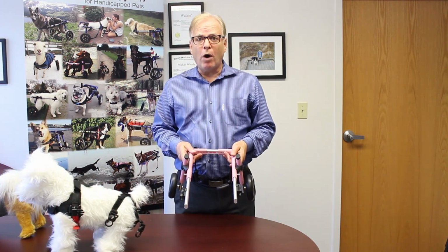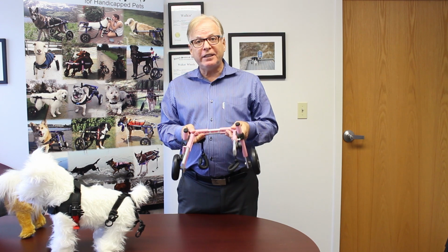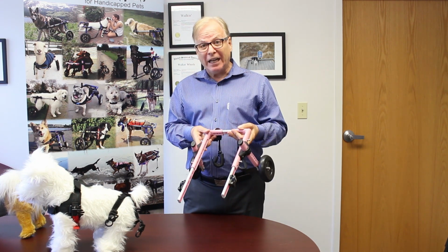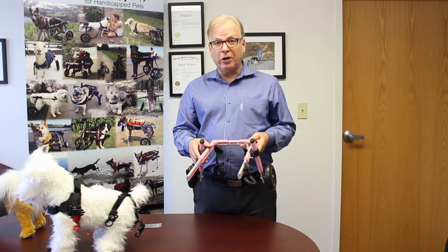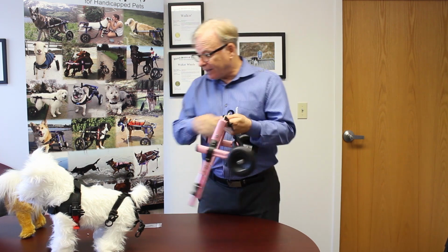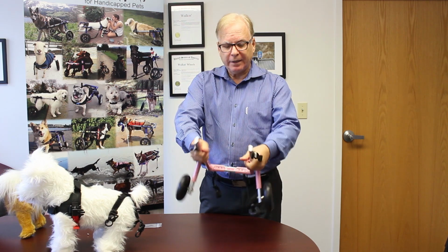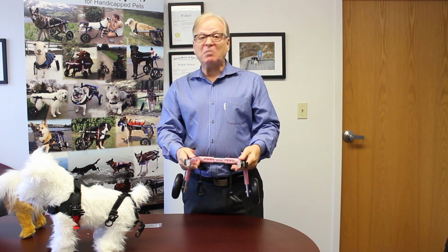You mentioned that the cart was a little bit wobbly. I understand that. When we originally designed the cart, it was suggested that we make the cart give a little bit and move some with the dog. And this was considered to be a feature. But you weren't the only one who didn't like it. So for those people who don't want the flexibility of the cart and would like a little more of a rigid cart, we added set screws. 2 set screws put in the back here with the included Allen wrench take all the wiggle out of the cart. Now it's a rigid wheelchair. So it's designed to be either way.